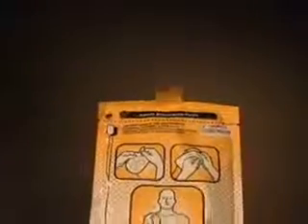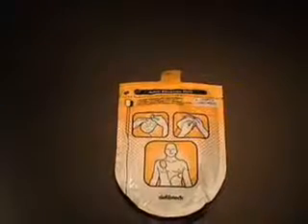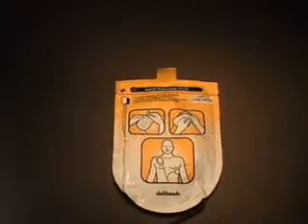The defibrillation pads are sealed in a single-use package. The package has quick-use instructions on how to use the pads. Do not open the package until the pads are required for use. The pads are connected to the Lifeline AED using the pad connector.